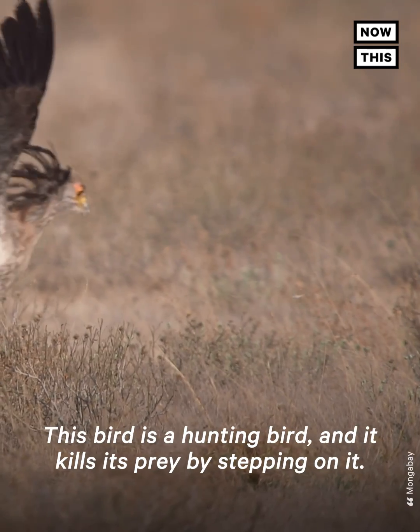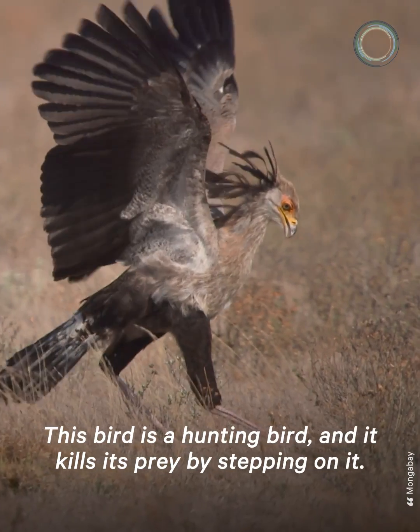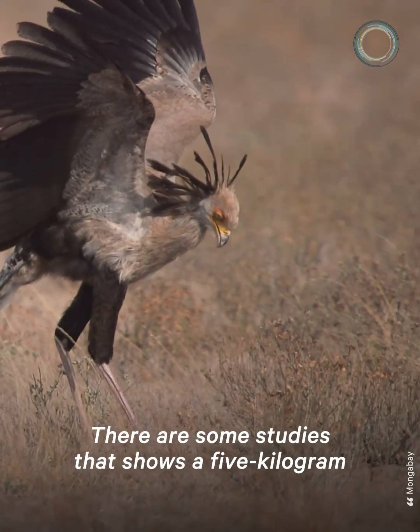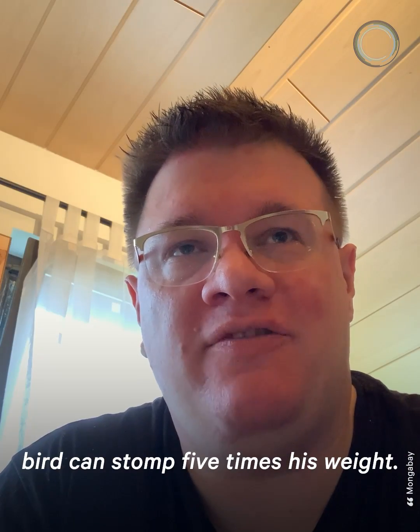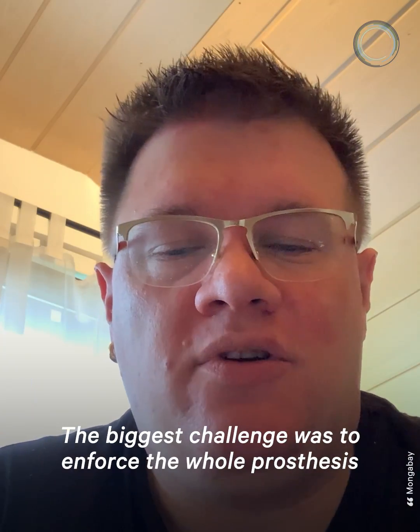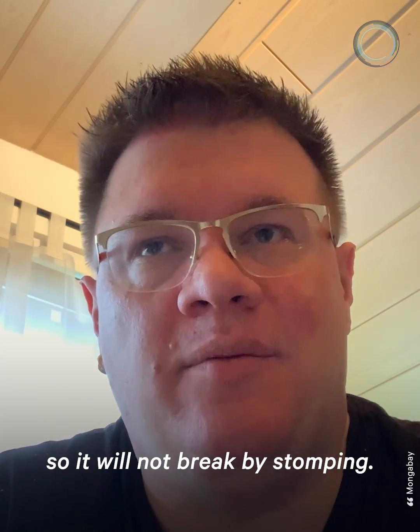This bird is a hunting bird and it kills its prey by stepping on it. There are some studies that show a five kilogram bird can stomp five times its own weight. The biggest challenge was to reinforce the whole prosthesis so it will not break by stomping.